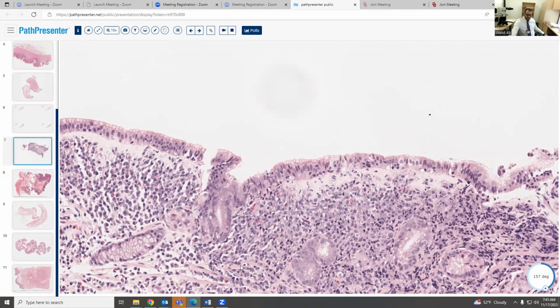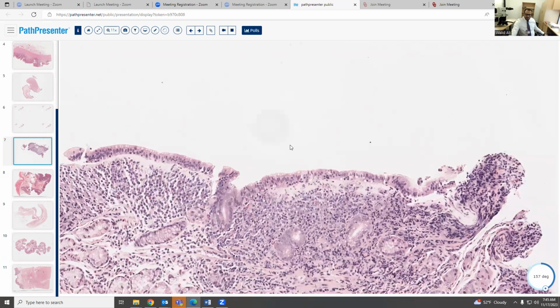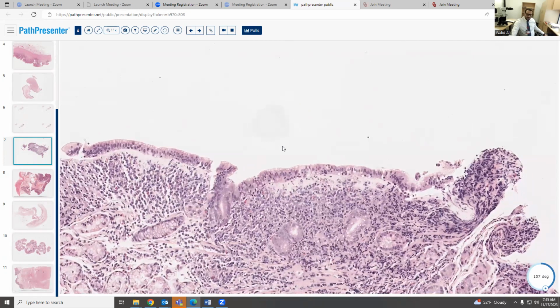It's lymphocytic colitis. It happens because of many reasons. It can be because of medications, autoimmune disease. There are so many reasons that can cause microscopic colitis, but it's very important to know the colon has to be otherwise normal. If there's any abnormality in the colon, you should think about something else.